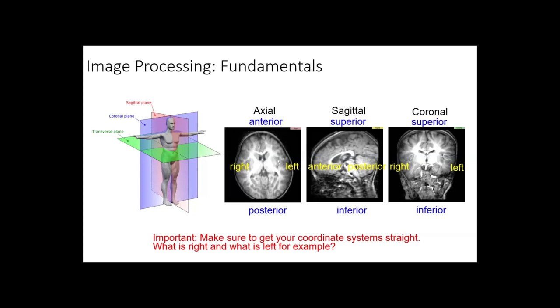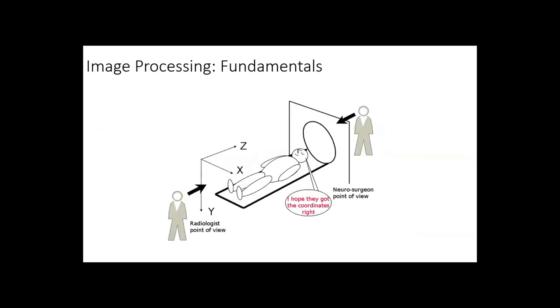And then we can also look at the brain in the other view. This is called the coronal view, and another view is the sagittal view. It really depends on the 2D projection from the 3D view. This is a term used in radiology. When you read a paper, usually when you see the transverse plane, it's basically the XY plane. This is basically the XZ, and another is the YZ. Let's move on to the next slide.